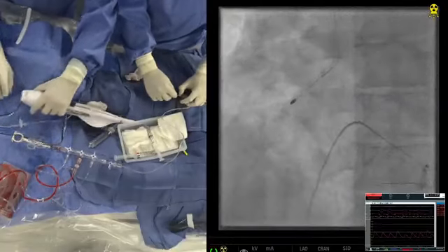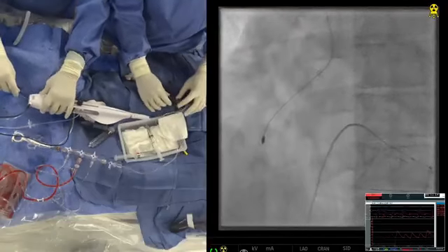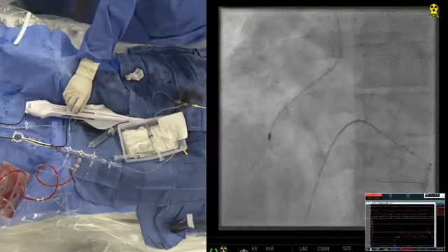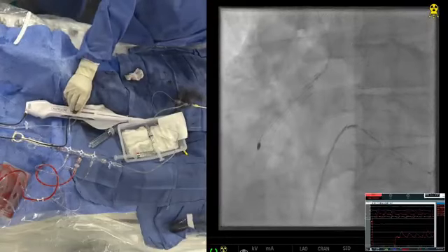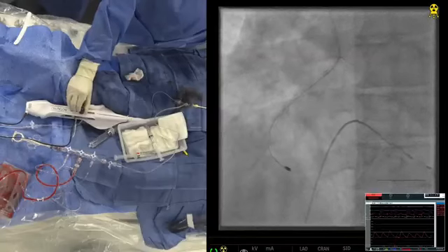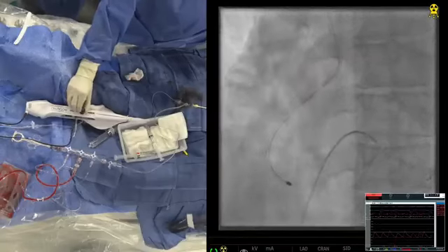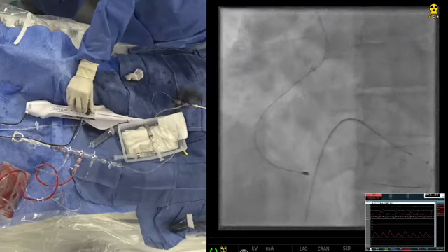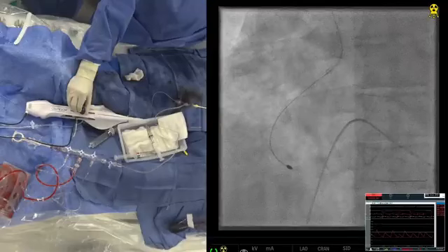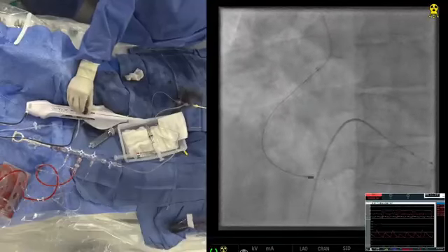Yeah, now you have to advance on the Dynaglide. You go. Good. Okay, stop. Yeah. So you see the advancement on the Dynaglide with a brake release. 30, 30, 5 seconds, 30, 30, 10 seconds, 130. Same tacking motion, touch and come back, touch and come back. Yeah. Now once you are there, you can do a good polishing.